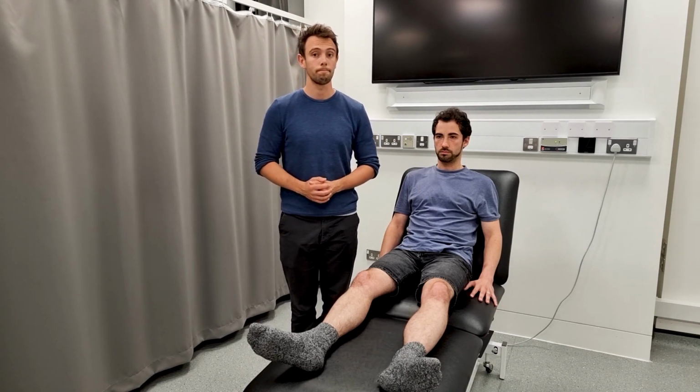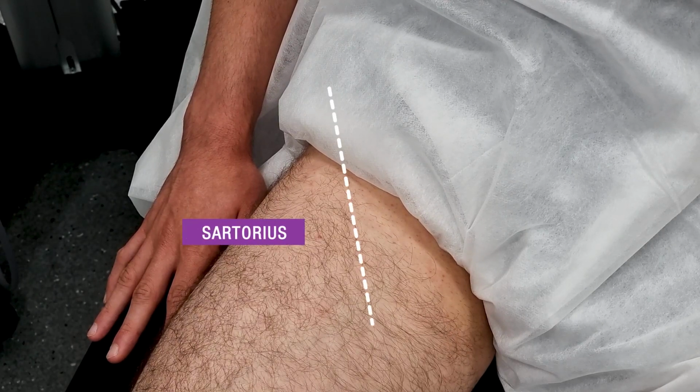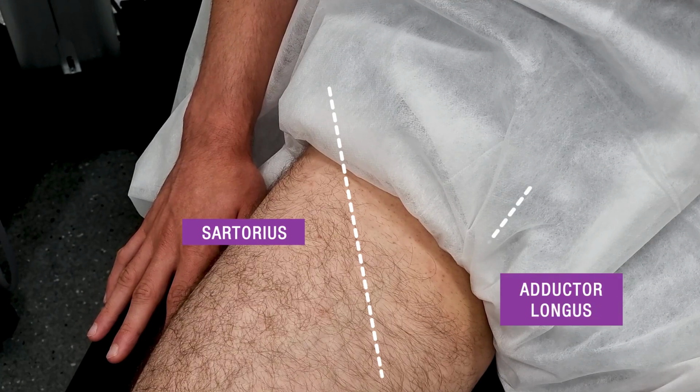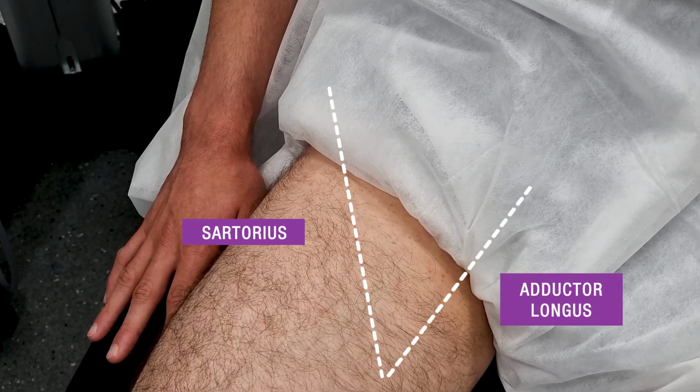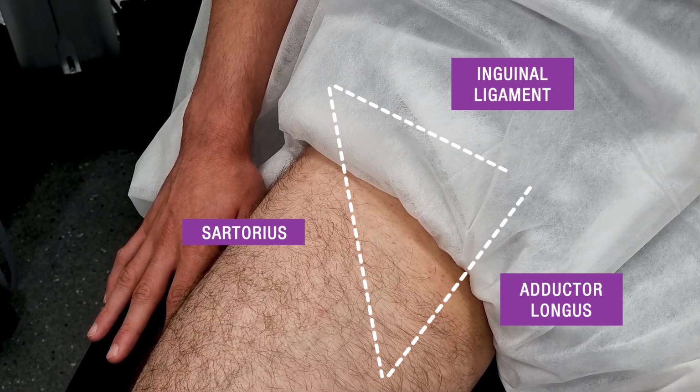We will now move on to look at the surface anatomy and ultrasound of the femoral triangle. The femoral triangle is not a prominent feature in most people. Its lateral border, the sartorius, and its medial border, the adductor longus, can stand out, especially if the patient was cross-legged. Remember, its superior border is formed by the inguinal ligament. The contents of the femoral triangle include the femoral vein, artery, nerve, and lymph nodes.